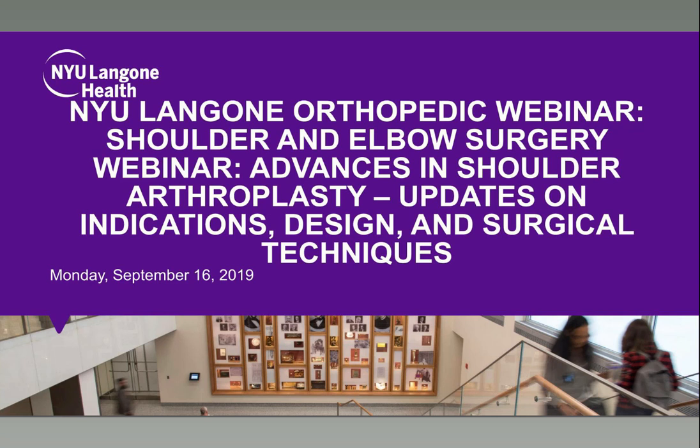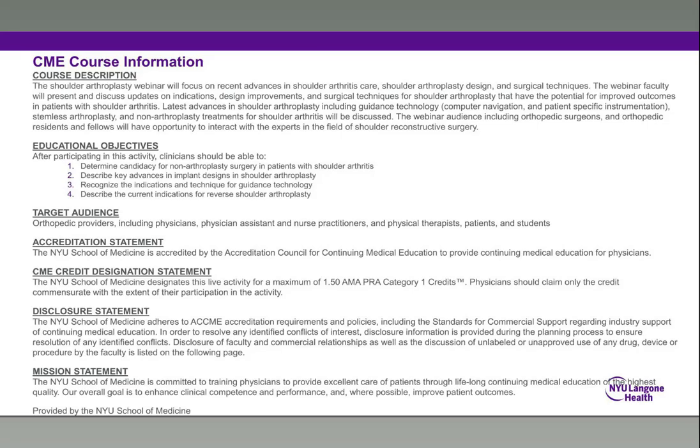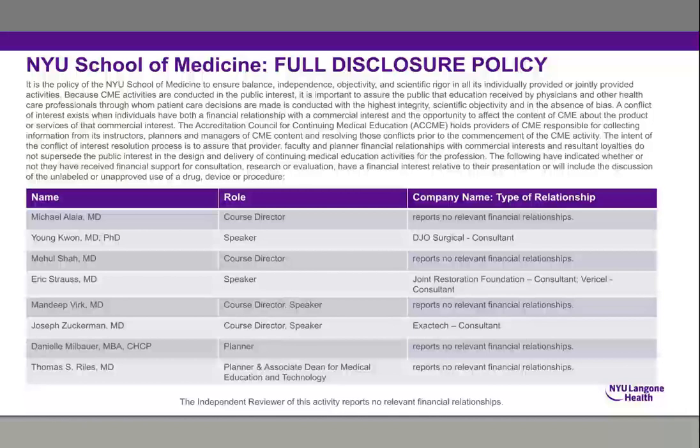No, there is a protocol that has to be followed. And usually these are much thinner cuts, the 0.6 millimeter cuts, so it can be segmented at the level of detail necessary for this. And that's something that, although I don't understand the technology involved, was relatively easily worked out with our radiology staff and IT people.